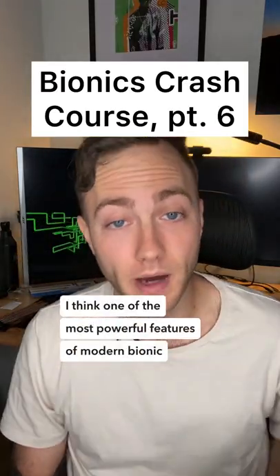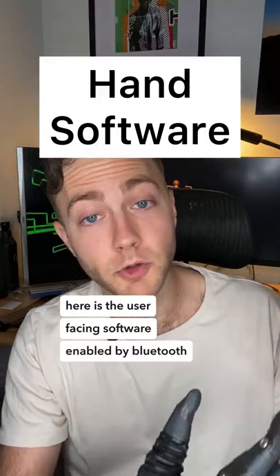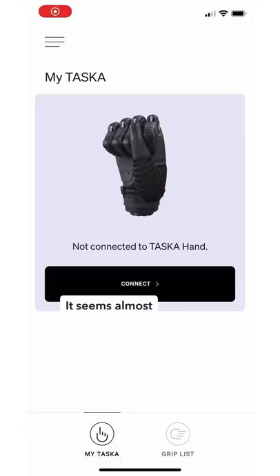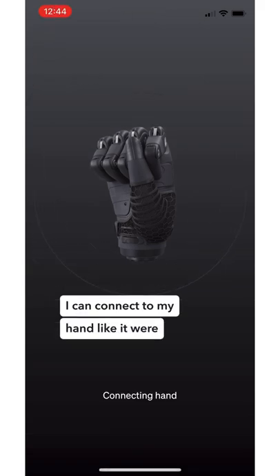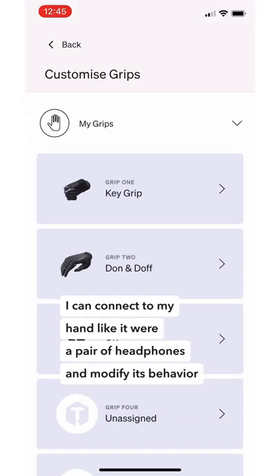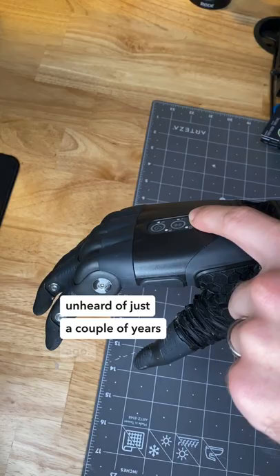I think one of the most powerful features of modern bionic hands, like the Tasca here, is the user-facing software enabled by Bluetooth connectivity. It seems almost trivial to think about it now, but the fact that I can connect to my hand like I'd pair a pair of headphones and modify its behavior without going to my doctor or even getting out of bed would have been unheard of just a couple years ago.